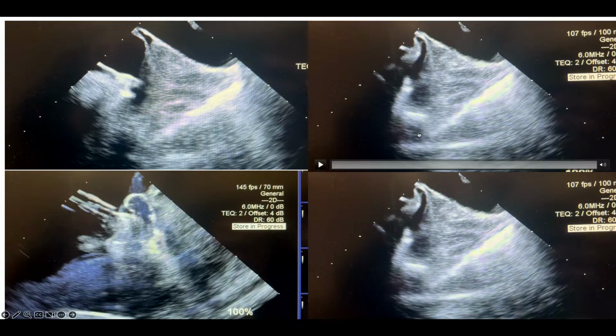Okay, colors, it's important to use colors, always. This is a mitral isthmus view, so you can see we have the mitral apparatus, no shoulders, no leak. And we can do the measurements also.